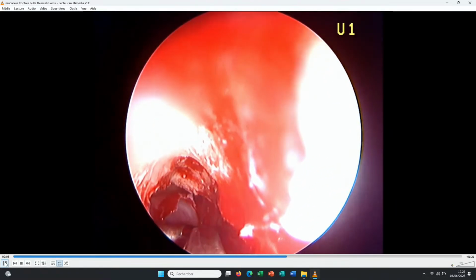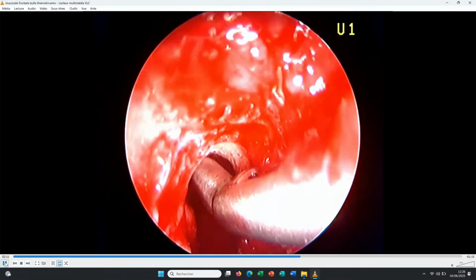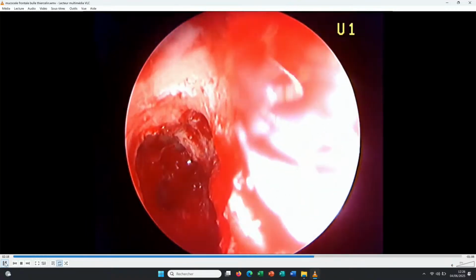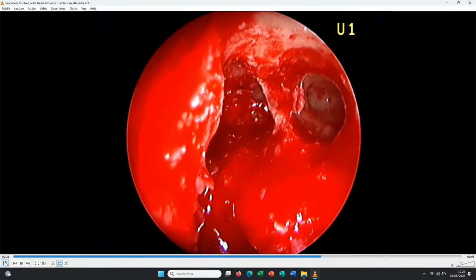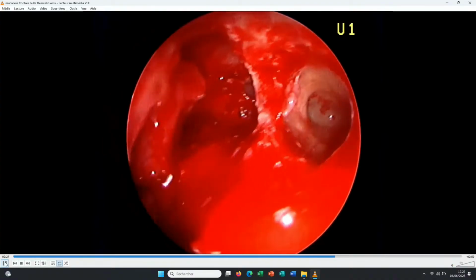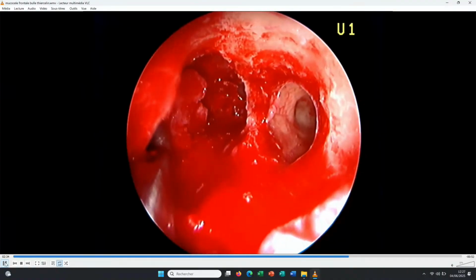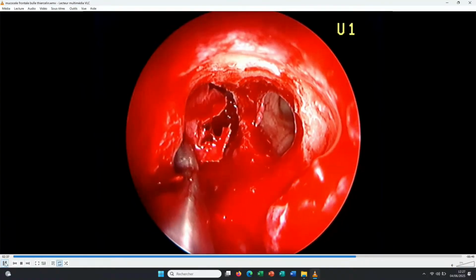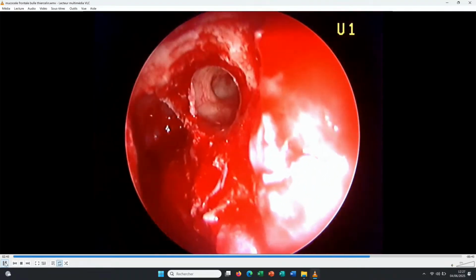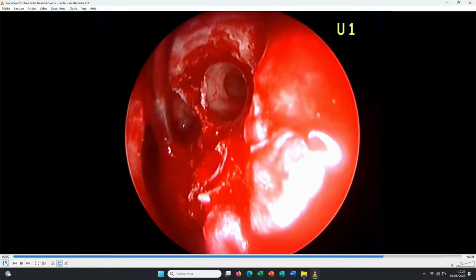Okay, so in this case, don't hesitate to change your strategy, because for the patient the postoperative period is the same whether you do a Draf 2A or 2B. So now this is a Draf 2B, and it's easier to introduce the dedicated instrument and to catch the wall of the mucocele, because in this case the objective is not marsupialization, but a complete resection like that. Okay, so the enlargement medially and superiorly allows us to reach all the wall of this mucocele.